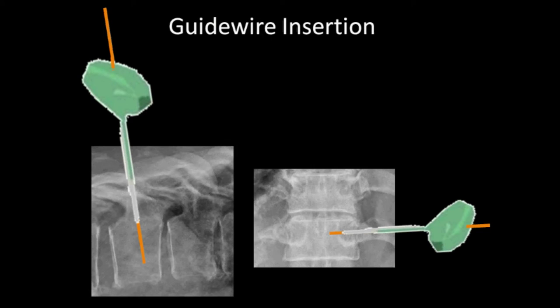A guide wire was then inserted through the Jamshidi needle into the cancellous bone, and the needle was replaced by the guide wire.